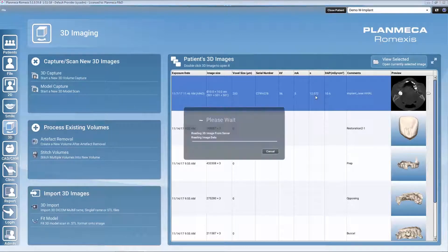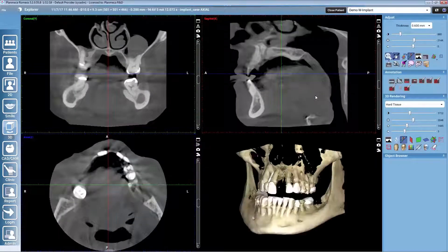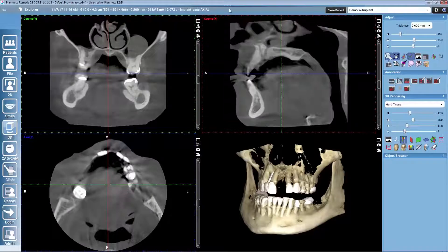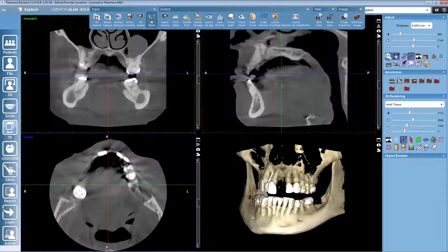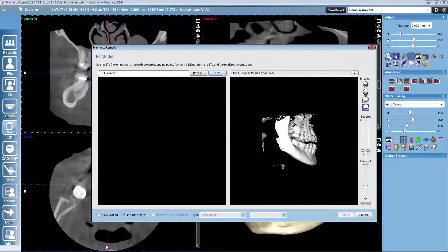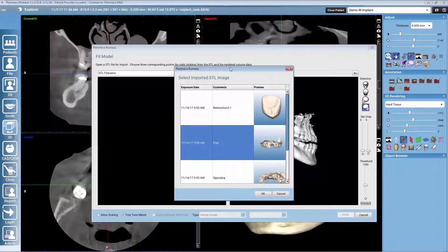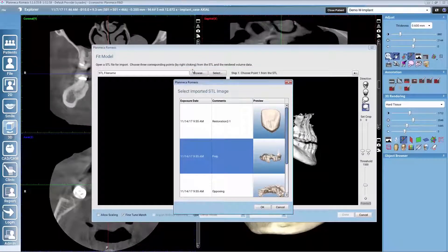First of all I will open up the 3D image for the patient — the CBCT — and we start by mapping the dental model to this image. We have an intraoral scan for this patient and we select it from the patient's data list. You could also bring any other STL file from other systems with the browse button.